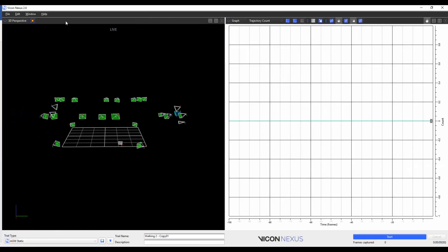The workspace that you have in the Normal Mode will appear in the Simple Capture Mode. For example, I have the 3D perspective and a graph displayed. This is then carried over to the Simple Capture Mode. However, I can still edit my workspace in the Simple Capture Mode if I want to.